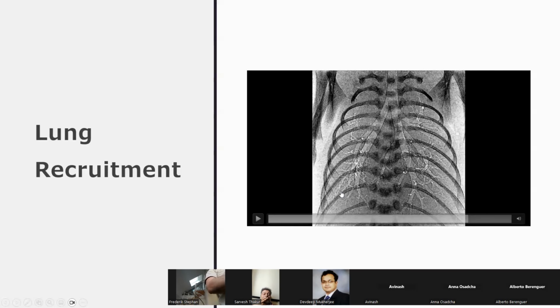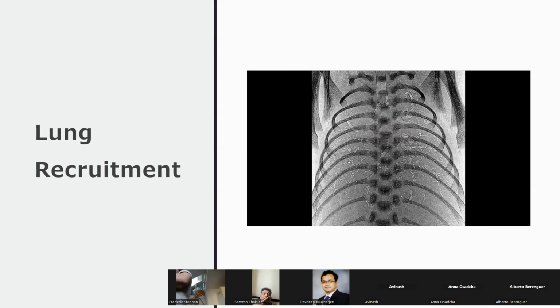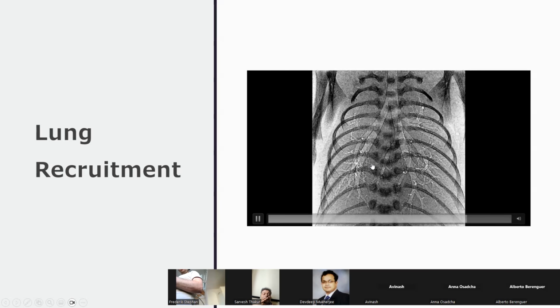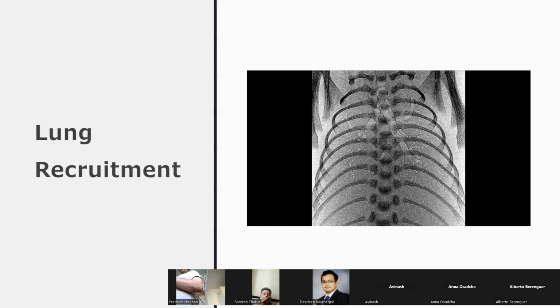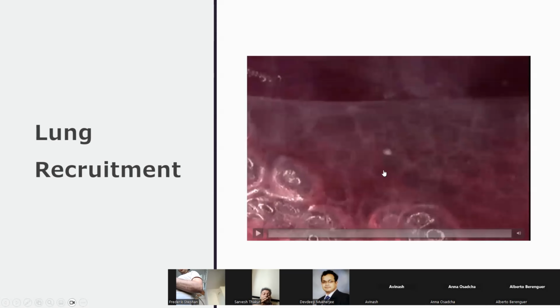If you're oscillating a baby, then from our perspective, what you'd be doing is increasing MAP. And how you do it and how fast you do it can actually have quite significant consequences on the heart. It can be very dangerous as well. I have seen babies developing pneumothoraces with recruitment maneuvers that are done too rapidly. Now, this is a PEEP that's going up by 5 every few seconds. And you can see how quickly the lung recruits, in particular the distal alveoli. The challenge is what you're not seeing is how venous return to the heart is actually deteriorating.